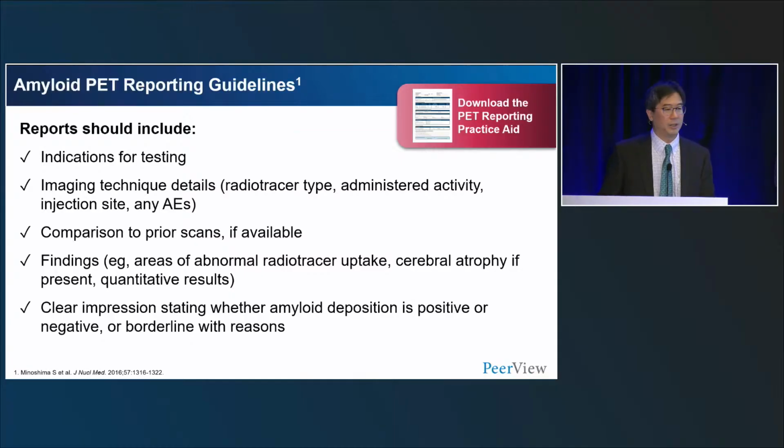And again, the impression though, keep it short and simple as we suggested, whether the amyloid deposition is overall positive or negative, and I would really deter people from saying anything's borderline unless there's a good reason, for example, a technical reason like patient head motion or something like that.